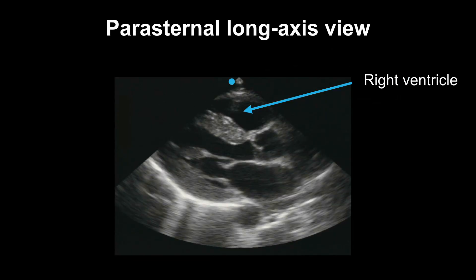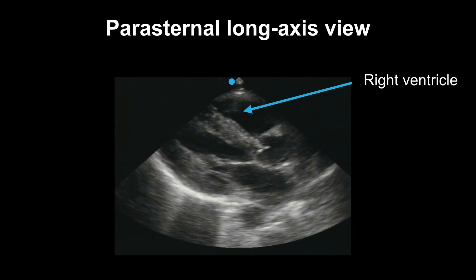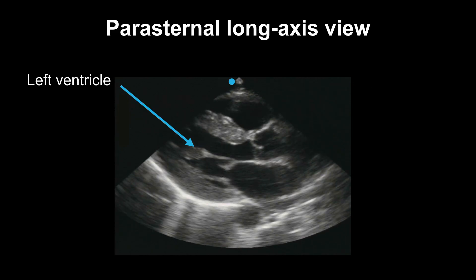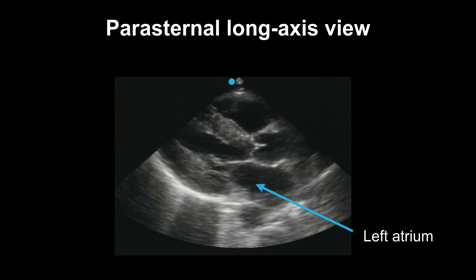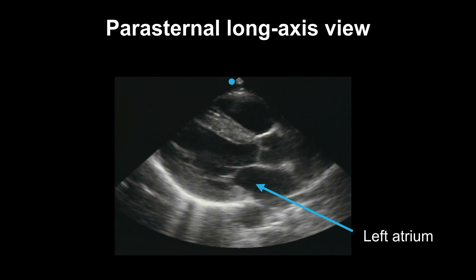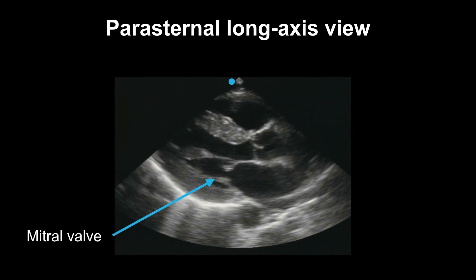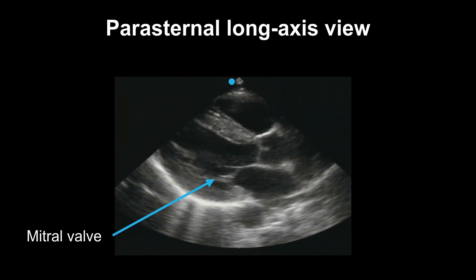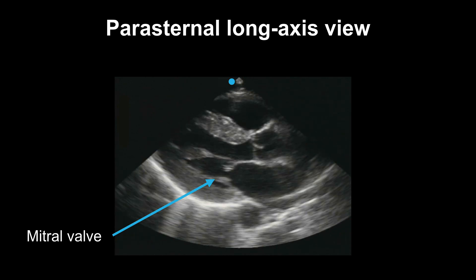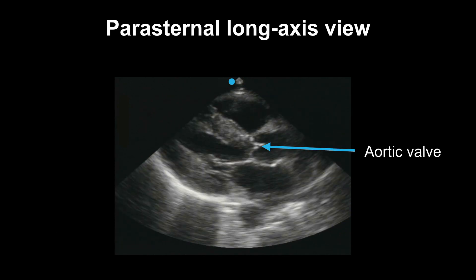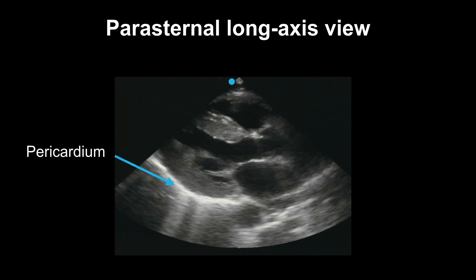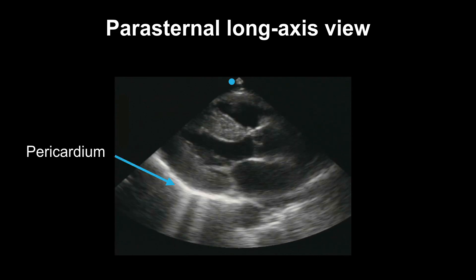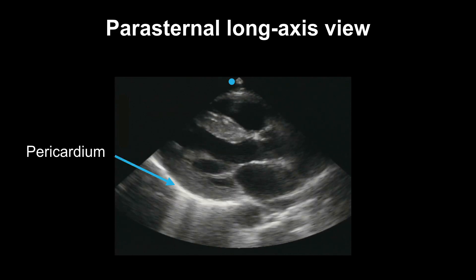Here's a video. Again, your right ventricle on the top, your left ventricle, your left atrium, your mitral valve with the anterior and posterior leaflets, and your aortic valve. Don't forget that your bright white pericardium will be surrounding your heart.